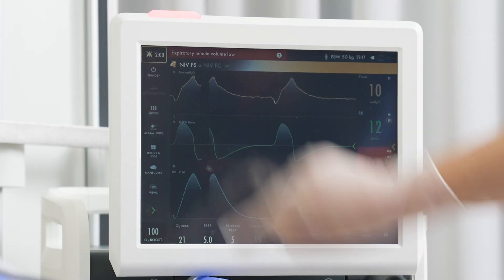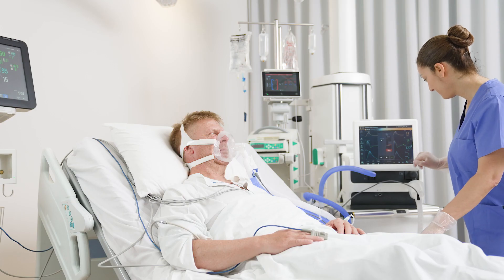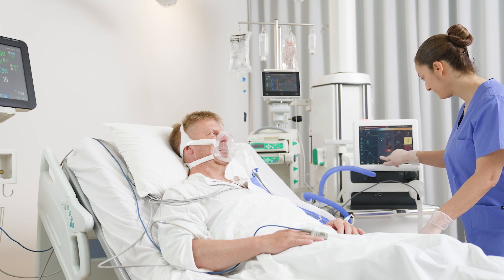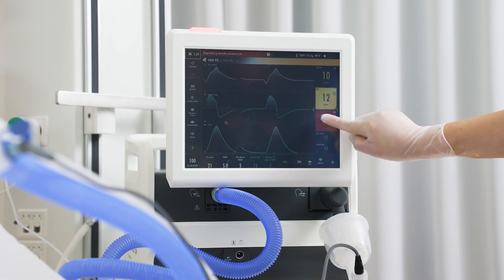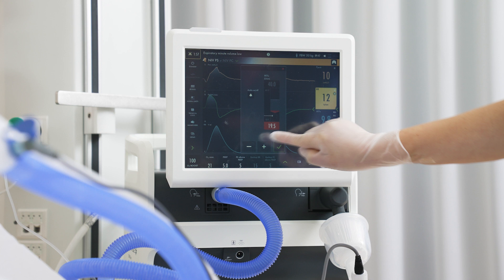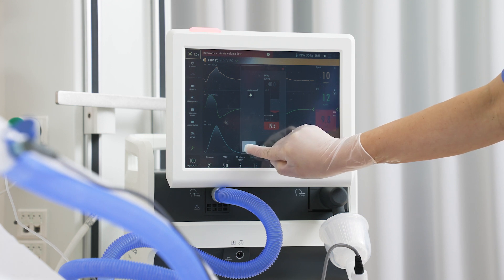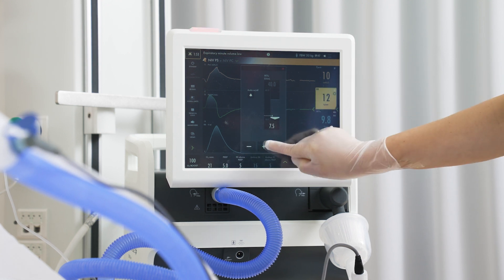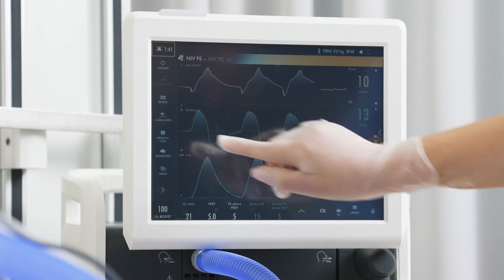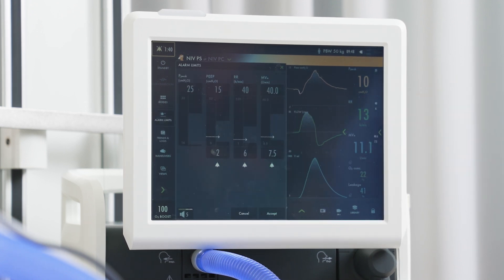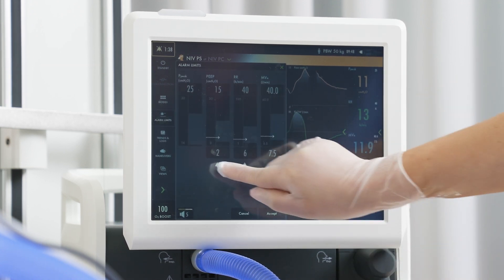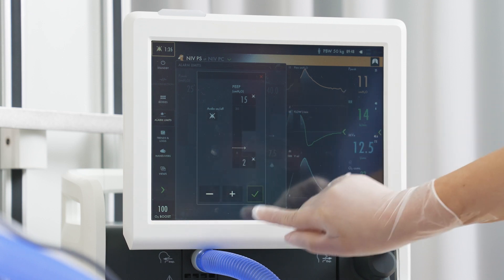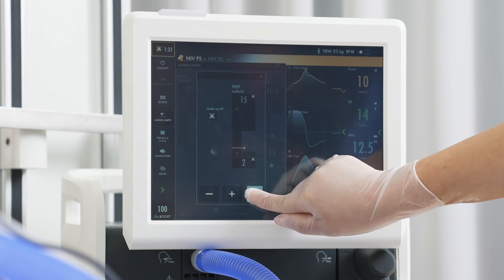To silence alarms, tap the bell. The alarms are then silenced for two minutes. By tapping on the active alarm value, you access a shortcut to that alarm setting. Certain alarms can be permanently silenced by touching the bell, which will silence the audible alarm only.